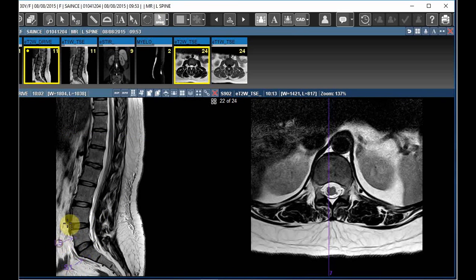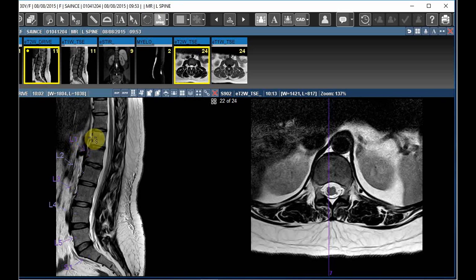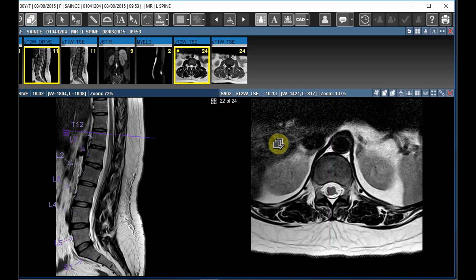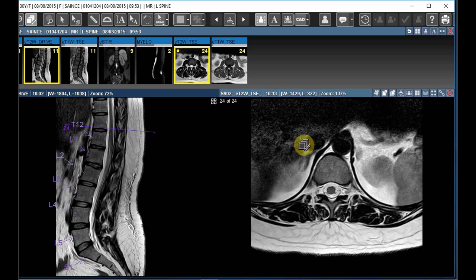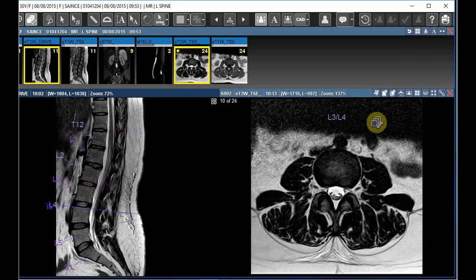Then do the labeling in the sagittal sections like this. Once you are done in the sagittal sections, the corresponding axial sections will be automatically labeled like this. Here it is showing automatically.